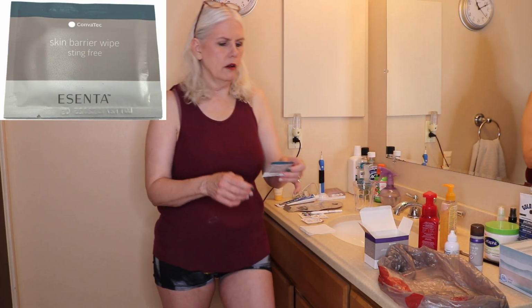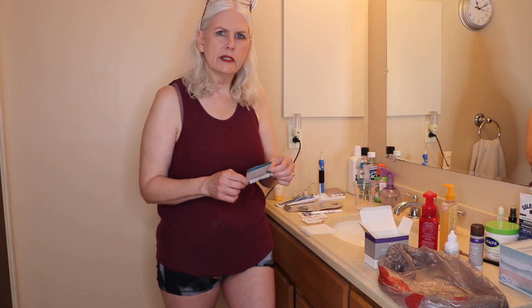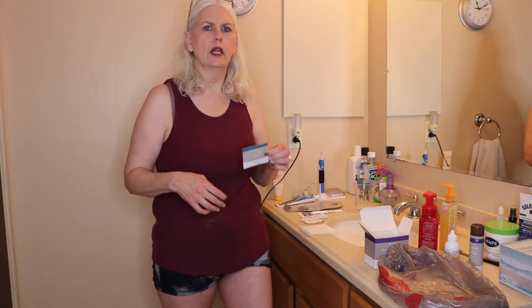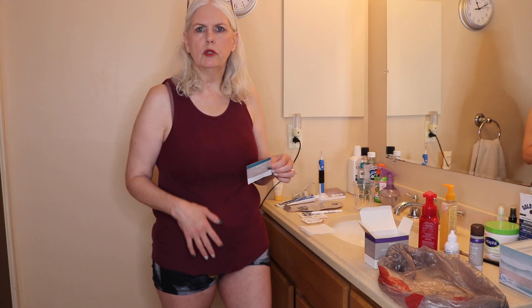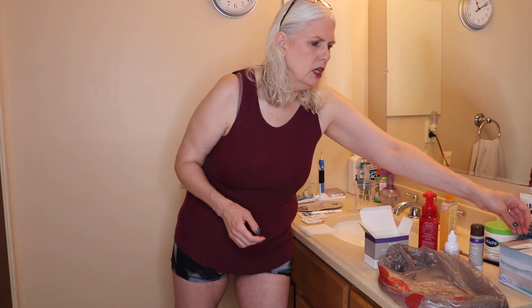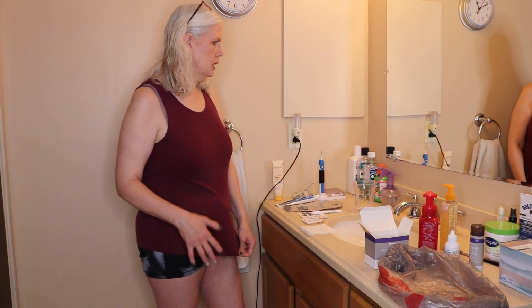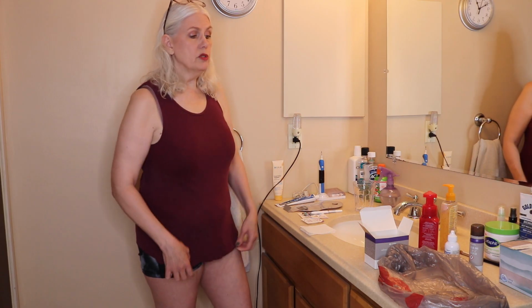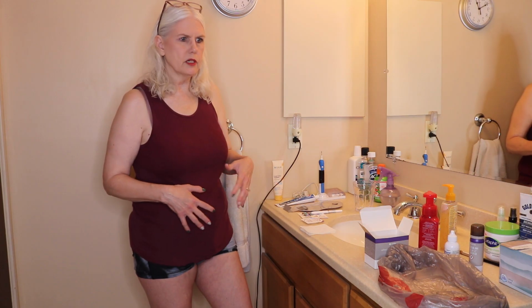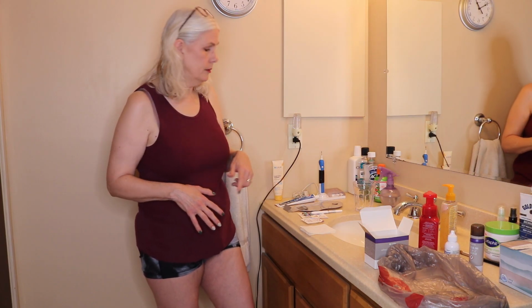And then also because of having that, I have a barrier wipe, which you use with the stoma powder. And sometimes you can use this even without. It adds just an extra layer of stickiness between you and your bag, so it can help it stick more. Or if you are having any other skin issues, when you use that, it also adds that extra barrier between you and the bag and will help heal that area. So hopefully the next time you change, it will all be good.